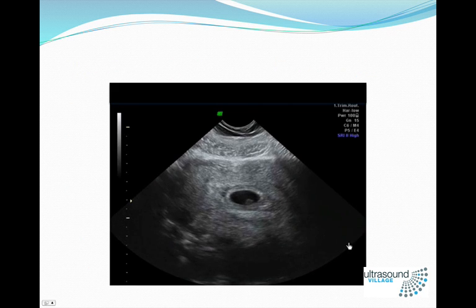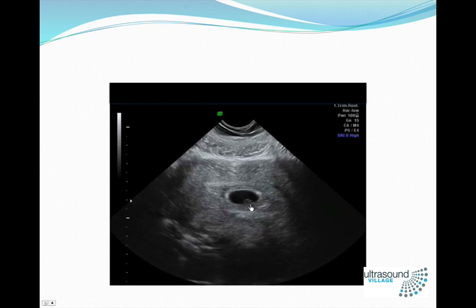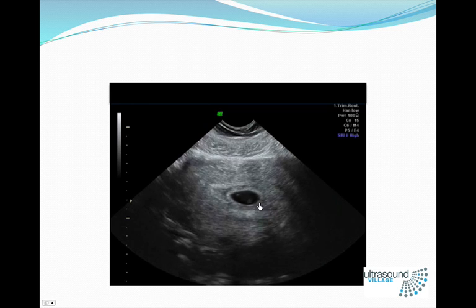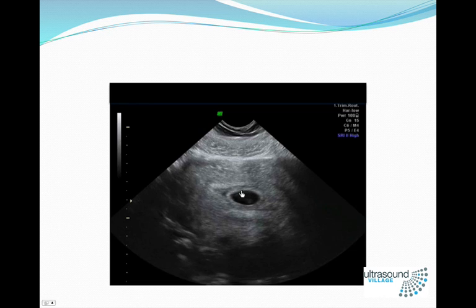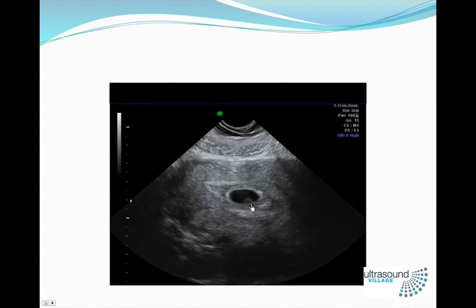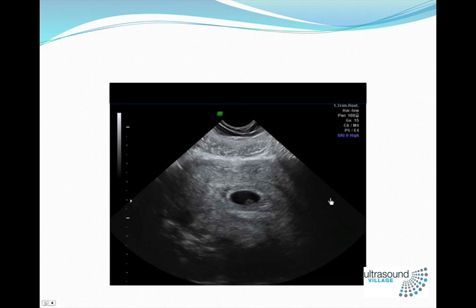This is a video of a 5-week and 5-day scan, and you can see a yolk sac, and in fact if you look very carefully you can see the very first signs of a fetal heartbeat. Watch that. You can start seeing a slow flutter, about 100 beats a minute. Gestational sac, echogenic rim, double decidual reaction. Okay, that's the double decidual ring there. This is the gestational sac, this is the yolk sac, and right here you can see a slow fluttering. That's the first contractions of the fetal or embryonic heart. This whole big thing here is the uterus.